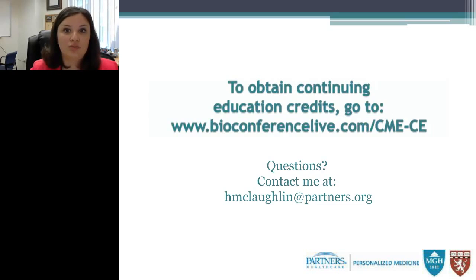We've decided to take a look at those every 3 to 6 months. So anytime we come across a variant again, basically by the time we see that variant again, we usually have to do a variant interpretation on it. And I will say that in our lab's experience, although it's a lot of work, for some variants it really does make a difference because there is new data out there.